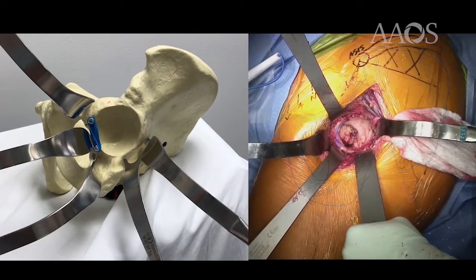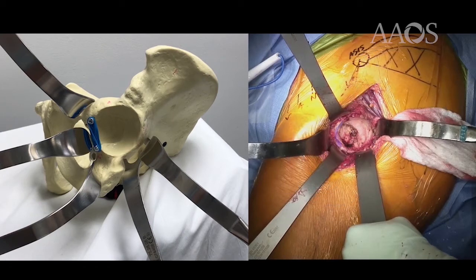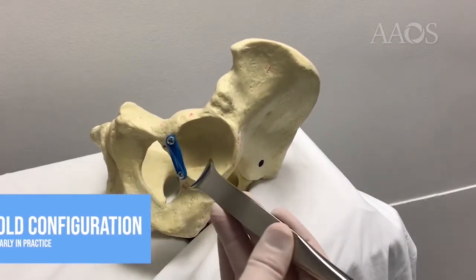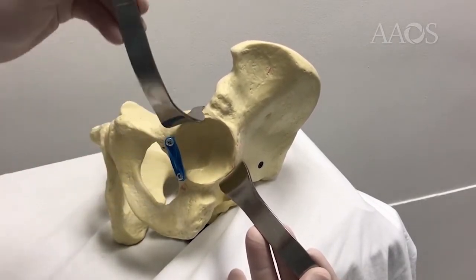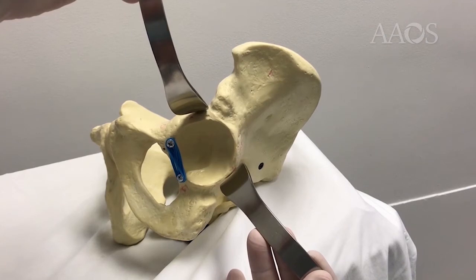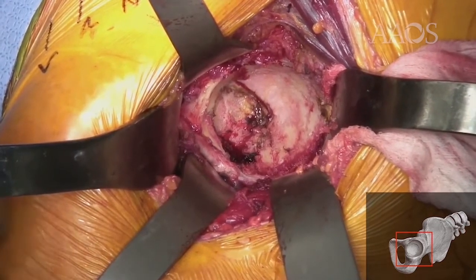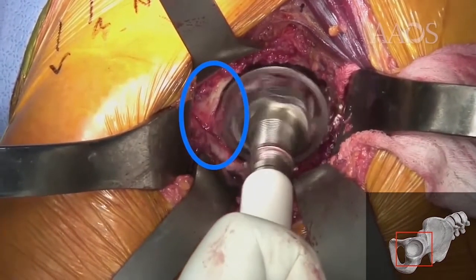A double-footed retractor can sometimes be helpful inferiorly to move the femoral shaft out of the way once the femoral neck cut is completed. Our older configuration used fewer retractors — a posterolateral retractor and an anterior brim retractor. The addition of these extra medial retractors around the posterior and anterior cotyloids allows us to get retraction and demonstrate the TAL throughout the reaming and preparation process.